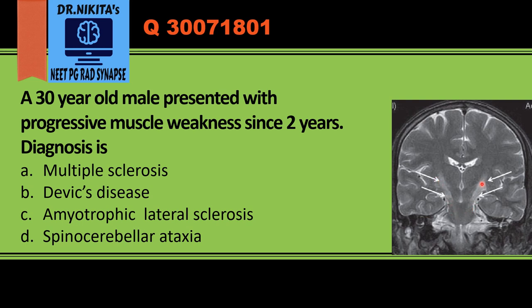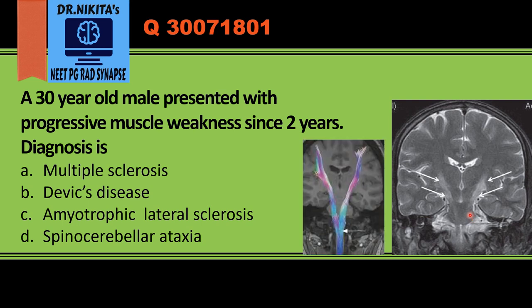So this is a T2-weighted MRI where we have this hyperintensity — that is white pathology — bilateral and symmetrical. Anatomically, this is along the corticospinal tracts, involving bilateral corticospinal tracts on each side. Bilateral symmetrical hyperintensity in corticospinal tracts is seen in amyotrophic lateral sclerosis.